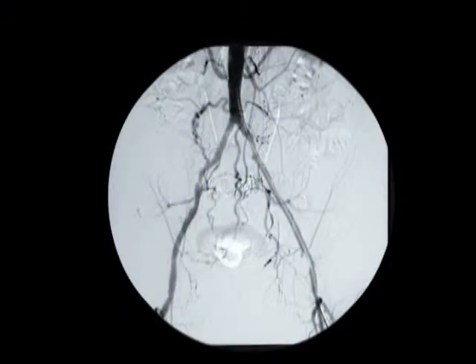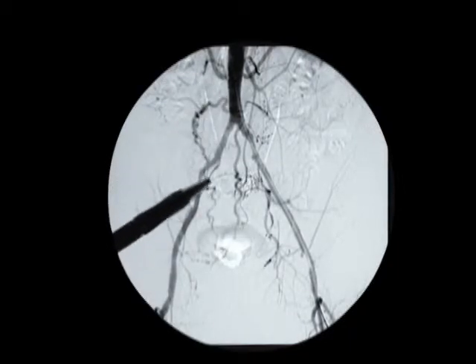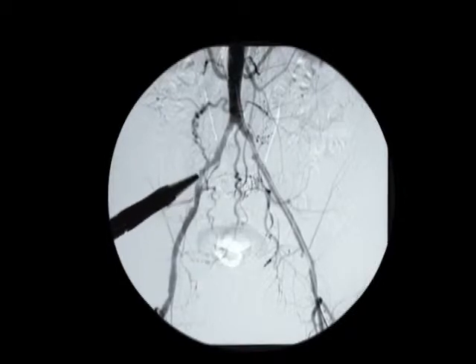In this study, we see an aortogram in runoff. Access is via the left femoral artery, and on the right side, we see a mild stenosis of the distal common iliac artery. This is hemodynamically insignificant based on catheter pullback measurements, and therefore no additional treatment is required for this lesion, and the lesion does not represent an exclusion from the trial.